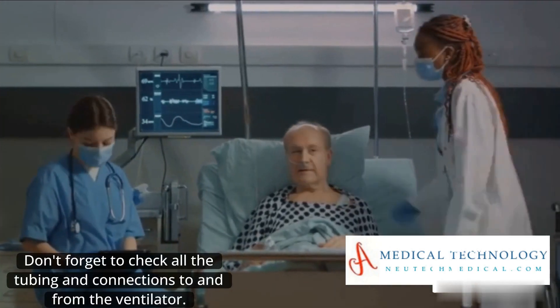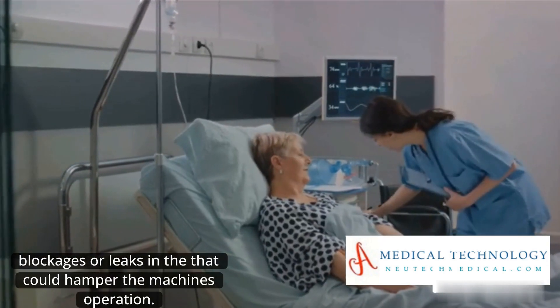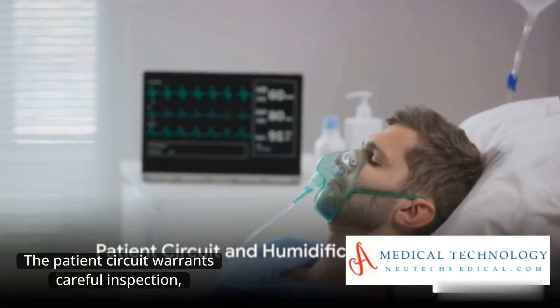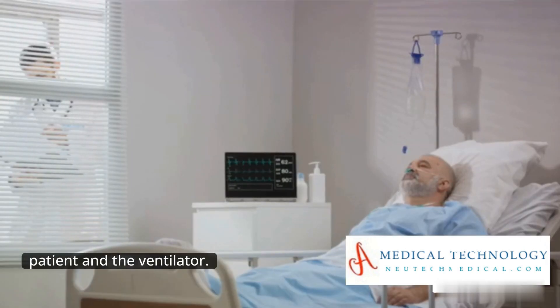Don't forget to check all the tubing and connections to and from the ventilator. You are looking for any kinks, blockages, or leaks in the tubing that could hamper the machine's operation. The patient circuit warrants careful inspection — check for any disconnections or damage and ensure it is properly connected to the patient and the ventilator.